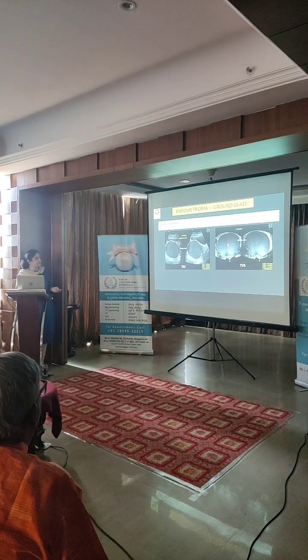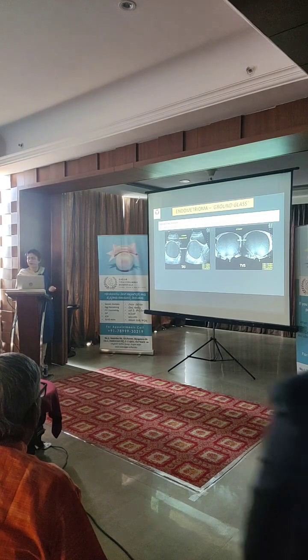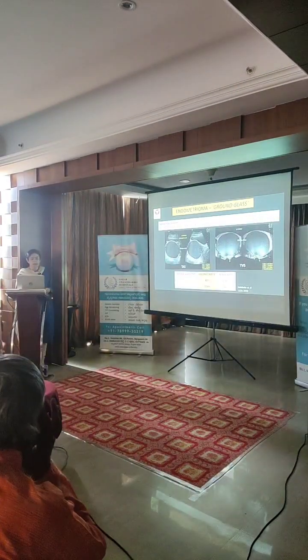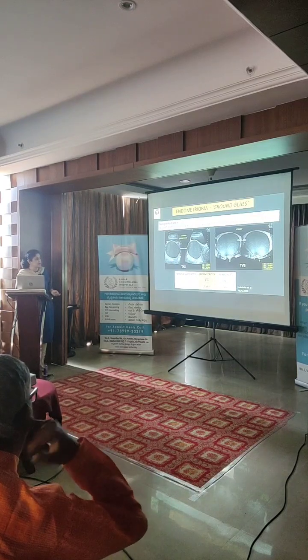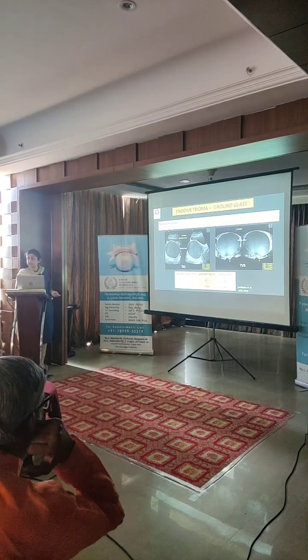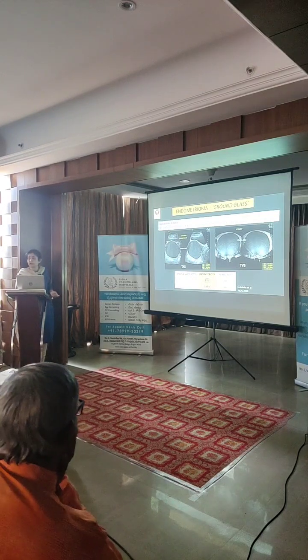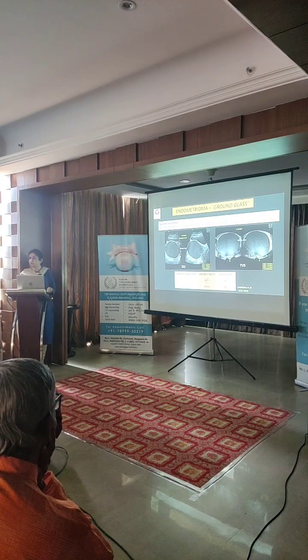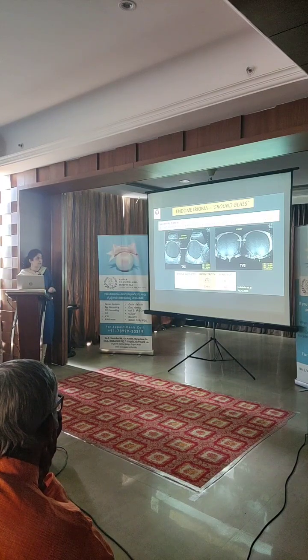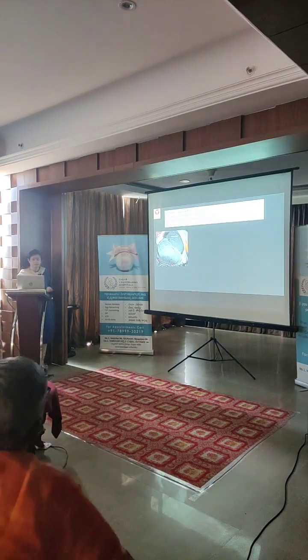We all know that these typical smooth, round, hypoechoic cysts with ground glass contents are classic of endometriosis. But it is very important to remember that not all ground glass cysts are endometriomas. In the premenopausal, yes, the majority are, but in the postmenopausal, the majority are malignant. So just because we see ground glass contents within a mass, it doesn't mean it is an endometrioma, and we should be very careful, particularly in postmenopausal ladies.